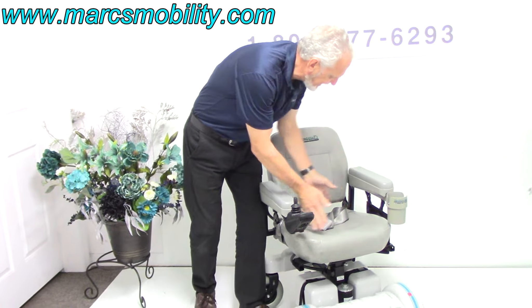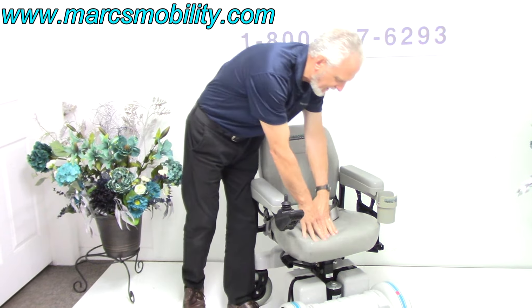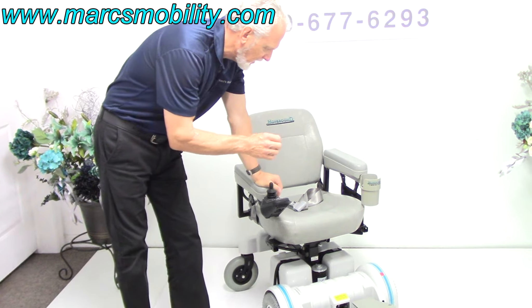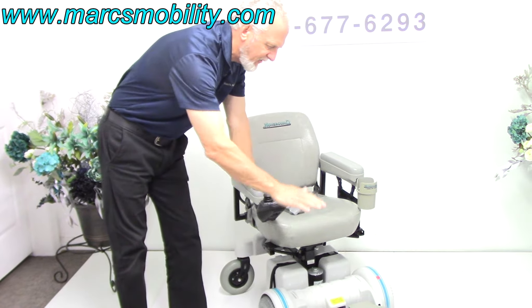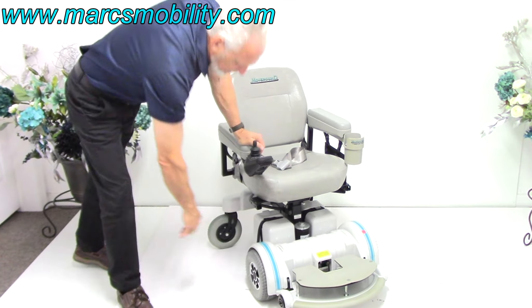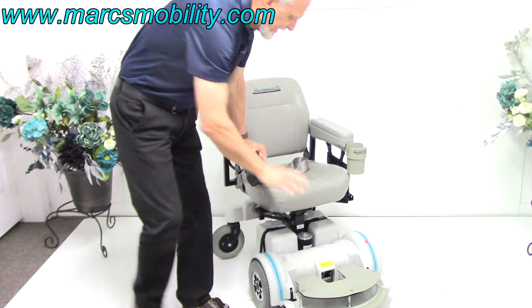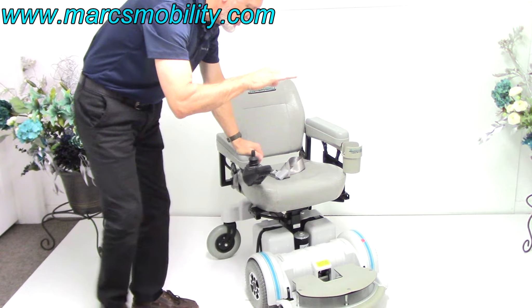The seat on this chair is 18 by 17 — 18 wide by 17 deep. It's a really nice seat. So again, this is the Hover-Round MPV-5 with the 5-inch seat lift in almost brand-spanking-new condition. All the knobs are on the tires, used less than 5 hours. It's got the extended foot plate, the HD motors, and the 5-inch seat lift.